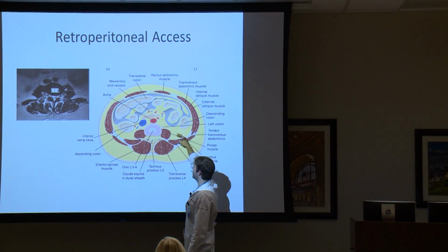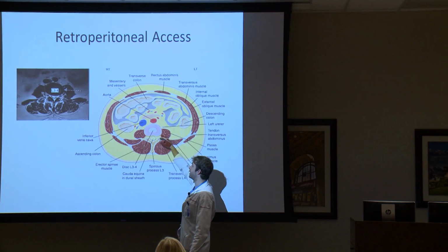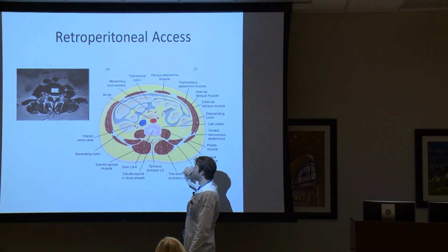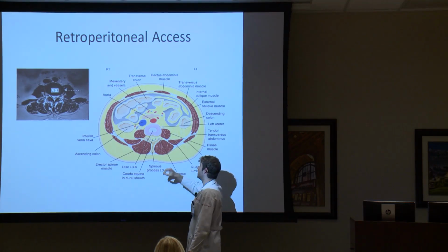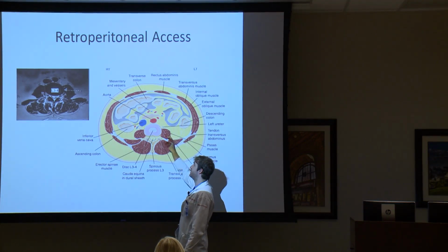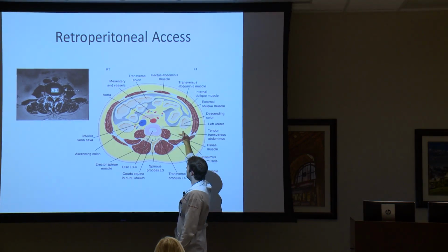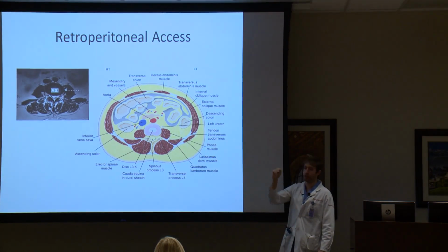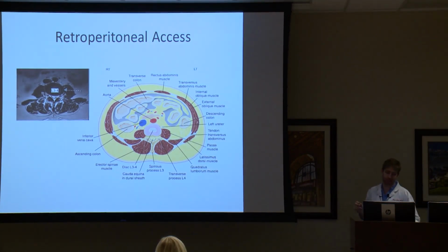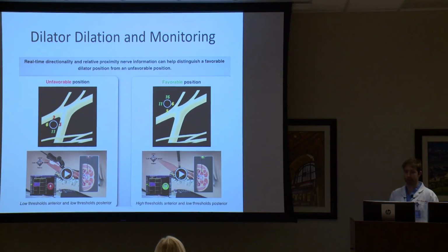And you just kind of come down with your finger and get around here. You can feel the bone a lot of times if they're small enough. I mean, I got pretty big hands, but you can get down there. If they're too big, you can't do it. You just got to base it all on kind of feel and your x-ray and your retractor, but you're coming right down through there, and you're not going to cut the psoas, you're just going to split it, and you're going to dilate it, and we'll talk about that in a second.